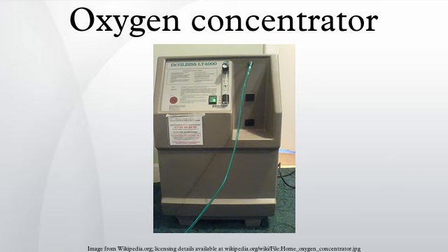Portable oxygen concentrators. Since the year 2000, a number of companies have produced portable oxygen concentrators. Typically, these devices produce 1 to 5 liters per minute of oxygen, and they use some version of pulse flow or demand flow to deliver oxygen only when the patient is inhaling. They can also provide pulses of oxygen either to provide higher intermittent flows or to reduce the power consumption.